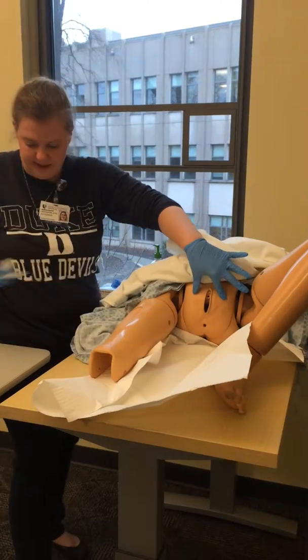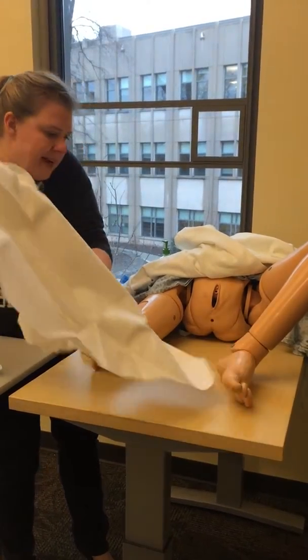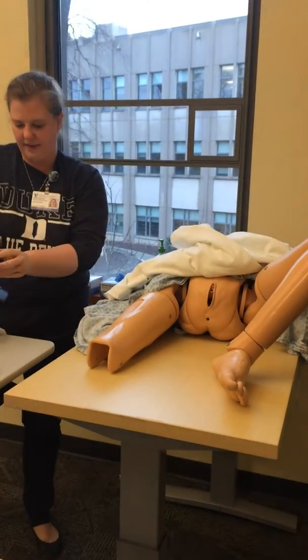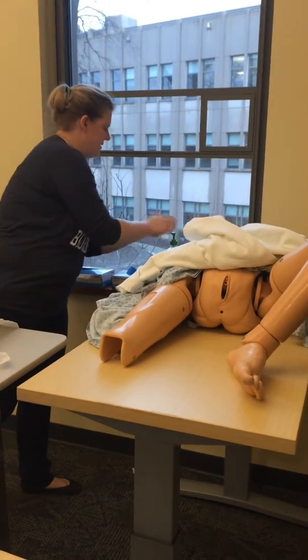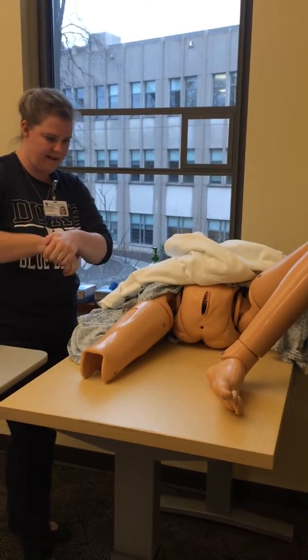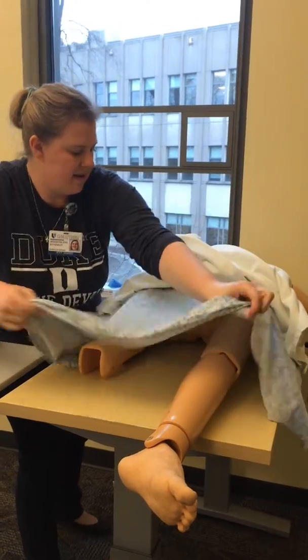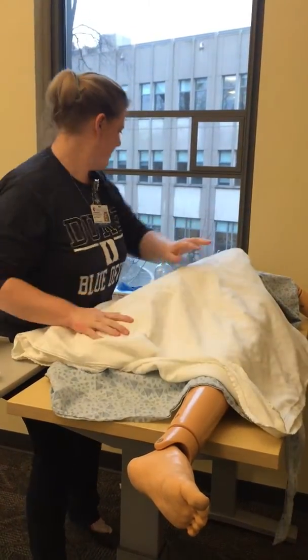Now I'm just going to remove this pad and put you back into a comfortable position. Let me take these gloves off and use hand hygiene. Let's put your legs back down. Thank you. I hope you have a good day. Thank you.